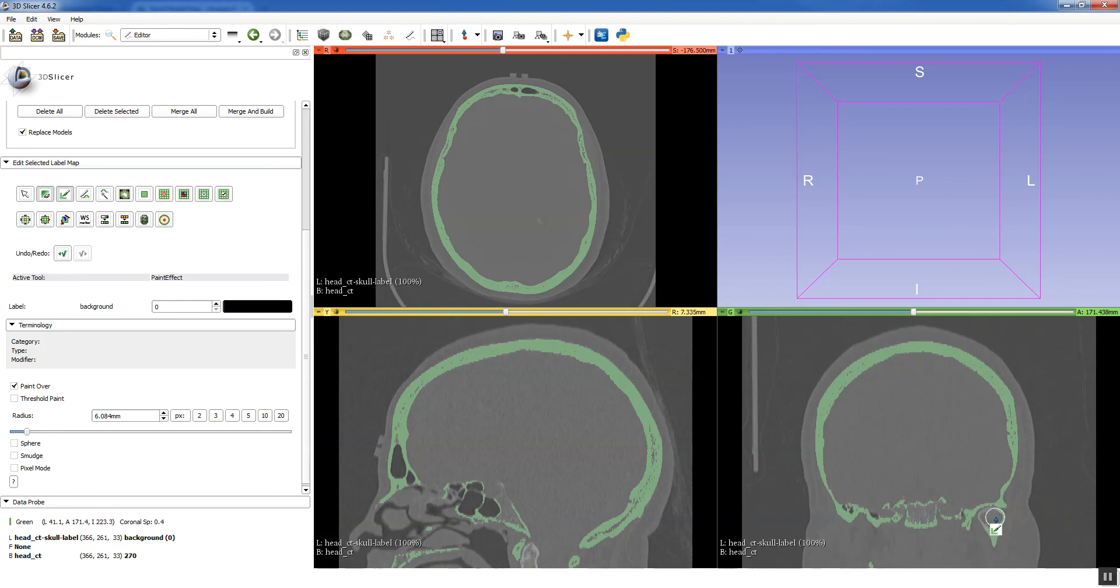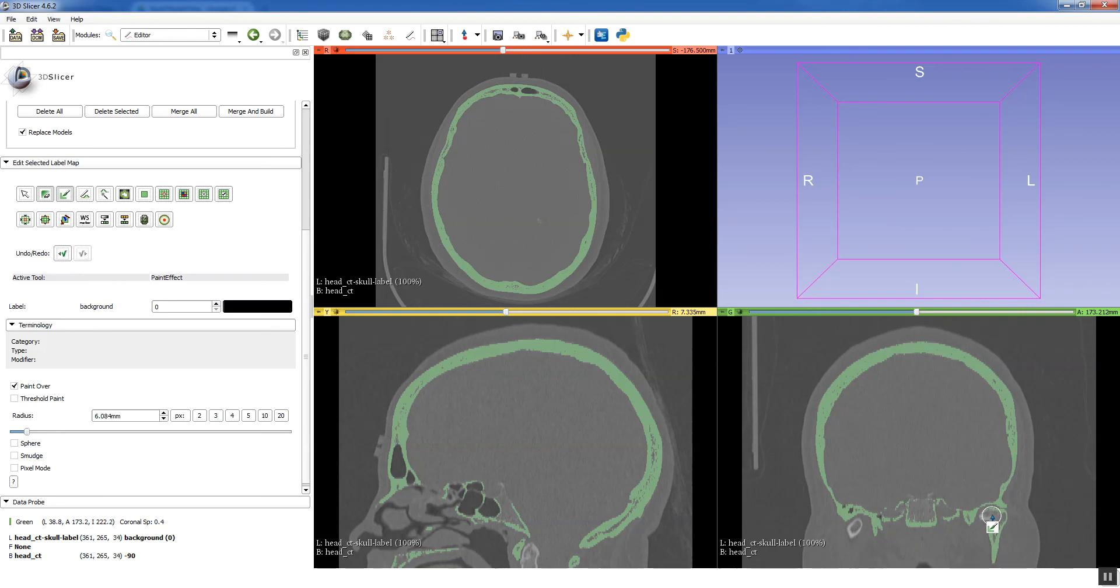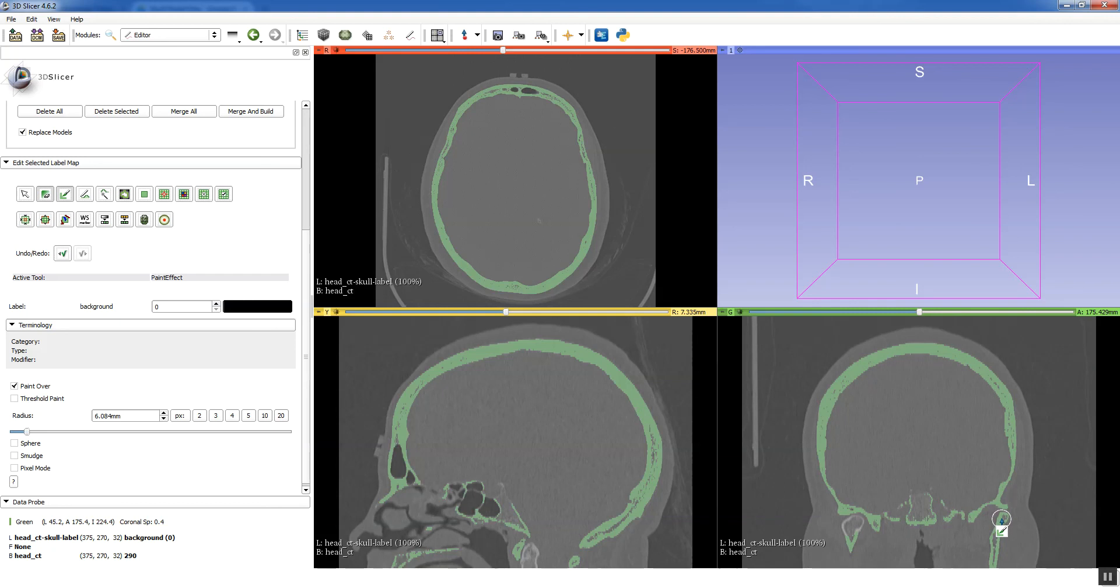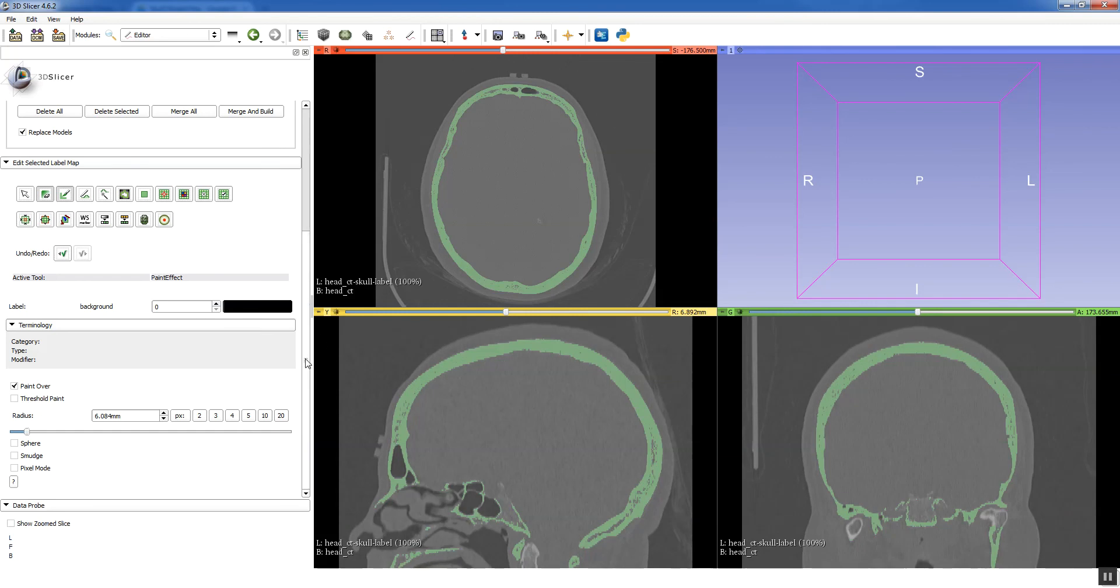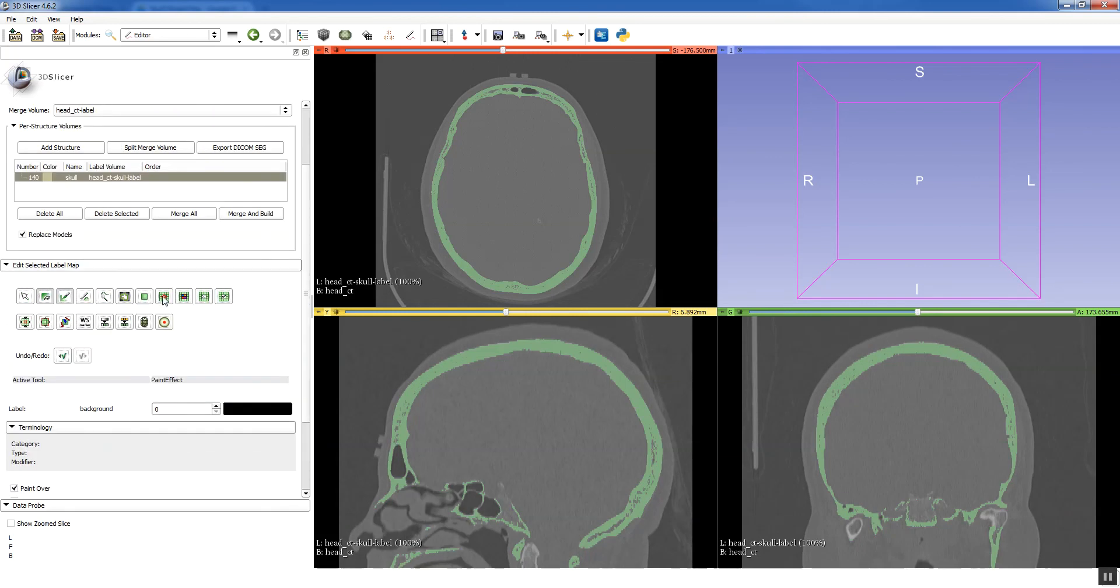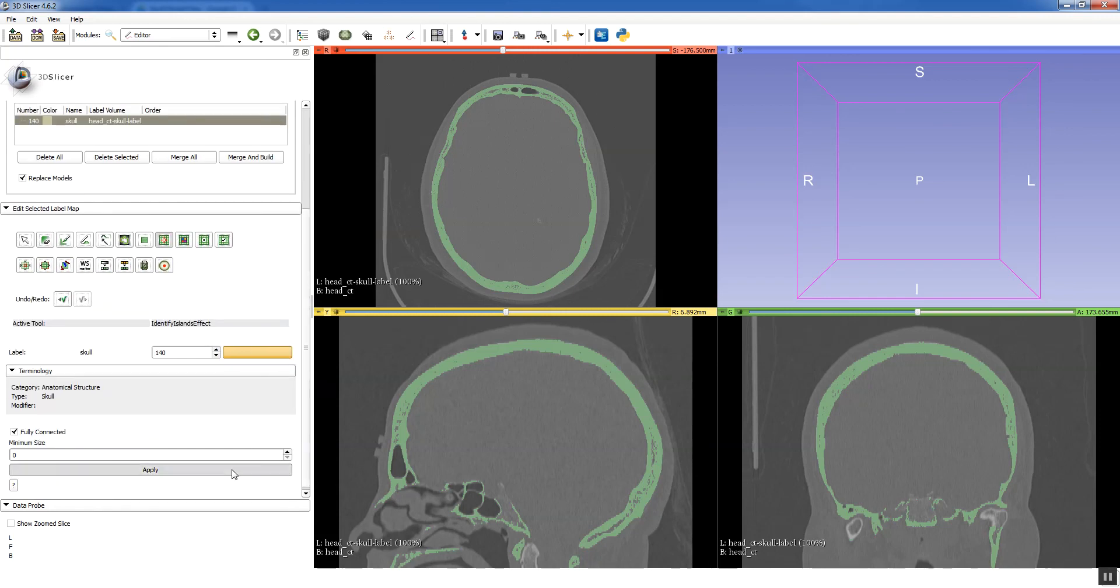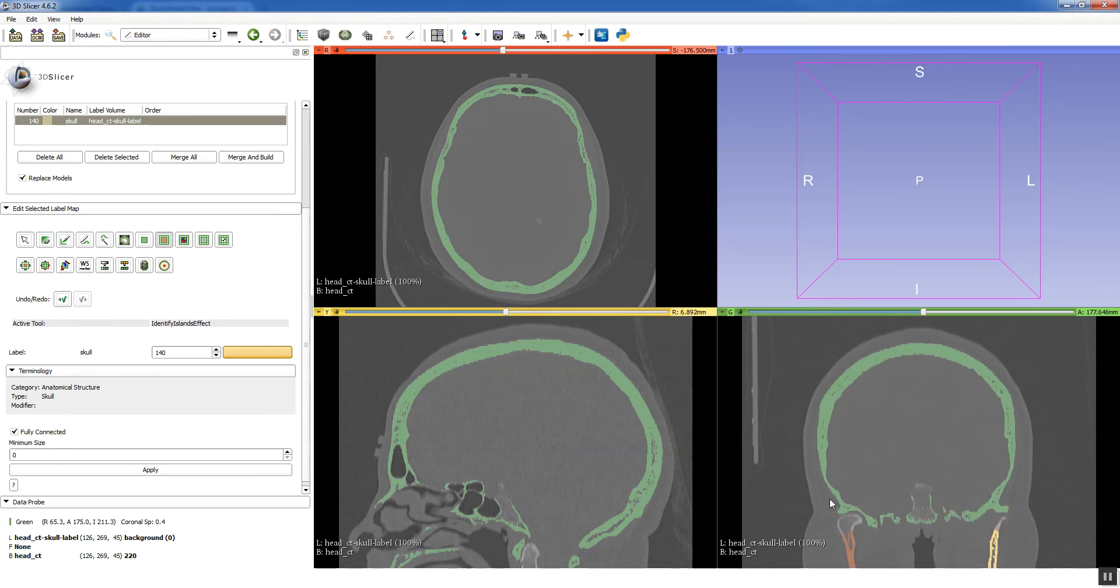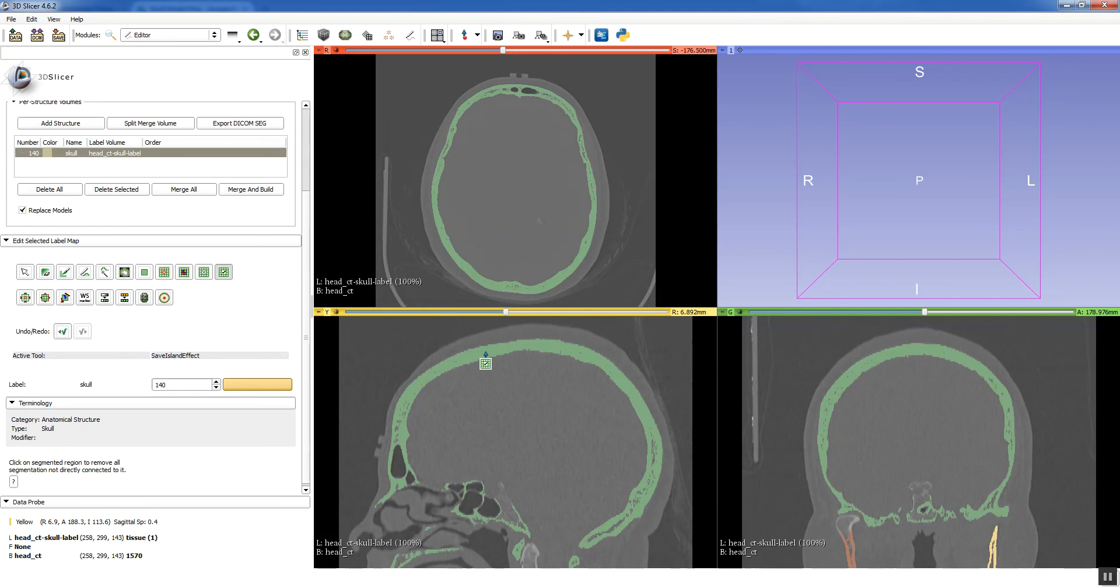Alright. So we have the right mandibular condyle disconnected. Let's go ahead and disconnect the left also. That's disconnected. I'm going to start there. This should just take a minute. Once we have the structure we don't want disconnected, then we just do another identify islands effect to remove it. And just a couple more slices. Alright. So it should be disconnected. Let's go ahead and identify islands again. Again, you have to click apply. I always forget to do that. And you can see here that the mandibles are different colors than the rest of the skull. So it worked. Now we want to save our skull island. And the mandibles disappeared.